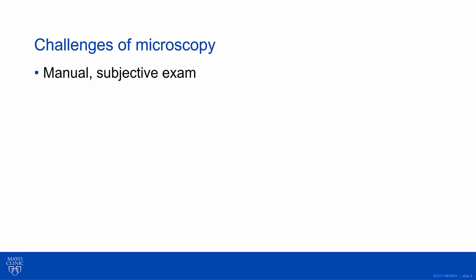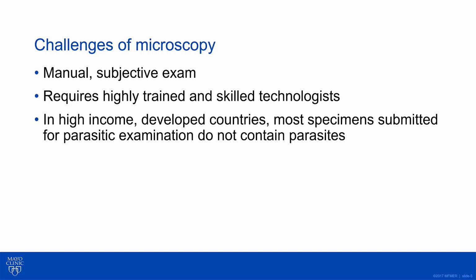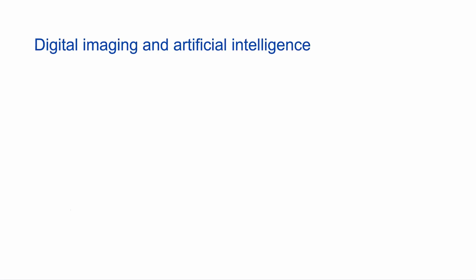It's a manual subjective examination, and it requires highly trained and skilled technologists. Also, in high-income countries such as the United States, most specimens submitted for parasitic examination do not contain parasites. So this leads to low staff satisfaction from screening negative slides, challenges in maintaining competency for detecting rare parasites, and then with high volumes, such as seen in my laboratory, we have a potential for ergonomic issues and also a potential to miss positive specimens amidst all of the negative specimens.